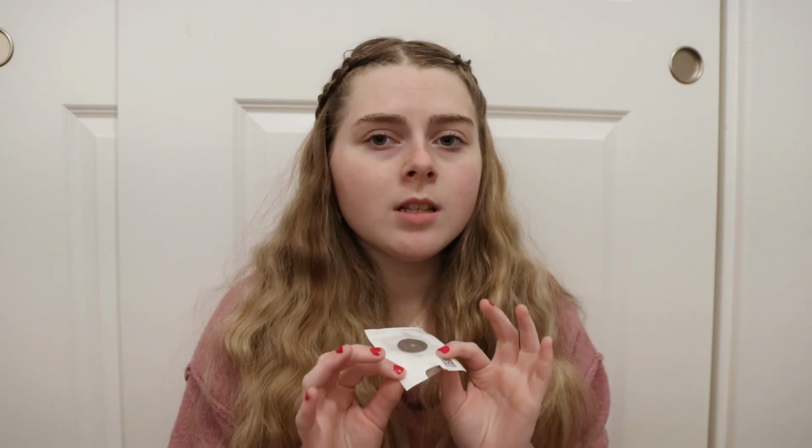I know this is not something that every nursing company has or every hospital has. It's very dependent on your nursing company or hospital. A lot of places don't have any hypoallergenic substitutes for a bio patch. So I have seen it where people go without any sort of disc around their insertion site.